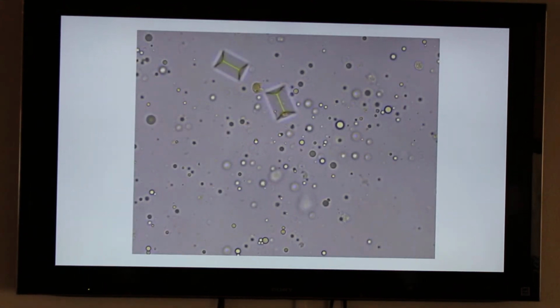So here's another image of struvites. So we have 2 struvites hanging out here, and we know because of the coffin lid shape. And then there's a white blood cell here. And then knowing that these are all fat droplets, they are not red blood cells. There's another white blood cell hanging up here in the top right corner. But looking at this refractile image that they show.